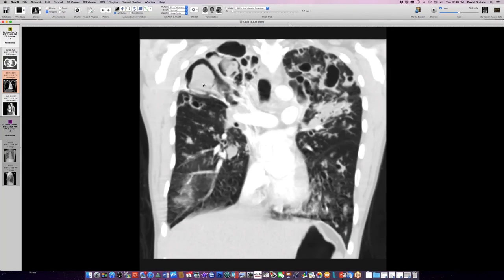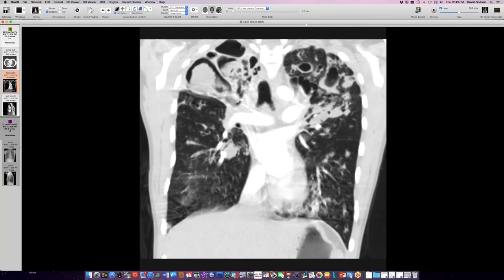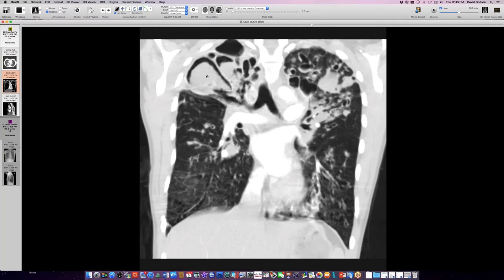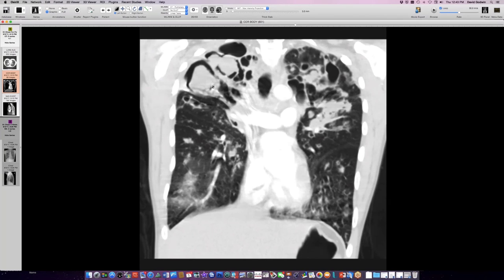Yeah, we call this the Monod sign. We try to distinguish it in the residents' minds from the air crescent sign, which is a different manifestation of aspergillus, where you're actually talking about invasive aspergillus. This is just passive occupation here of these cavities by mycetoma. So although it's crescent-like, it should not be called air crescent sign, because it confuses people with manifestations of invasive aspergillus versus just passive occupation mycetoma kind of aspergillus. Very interesting. Okay, those are my cases.